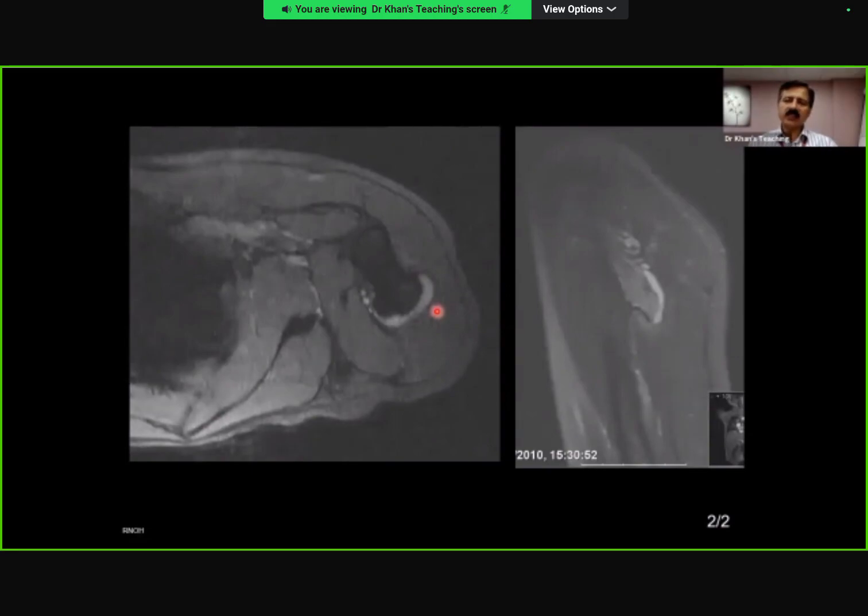I repeat, less than 1 centimeter means it's black and white benign. More than 2 centimeter, it means that it is malignant. And in between is a gray area, because even if you don't have to remember growing skeleton and adult skeleton, you just remember it like that. And please remember, if it is a gray area in the exam, you have to tell the examiner, I want to measure it. So, of course, if he or she wants you to measure, they will let you measure on PACS, on the software, I mean to say.